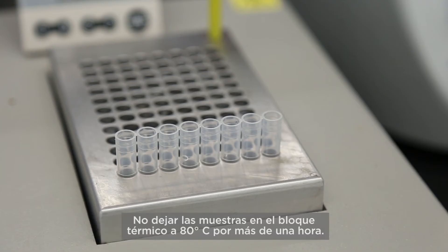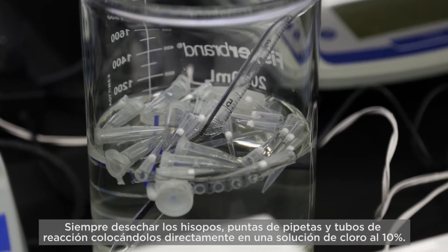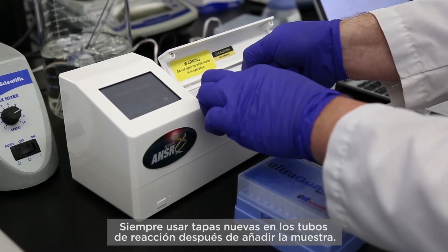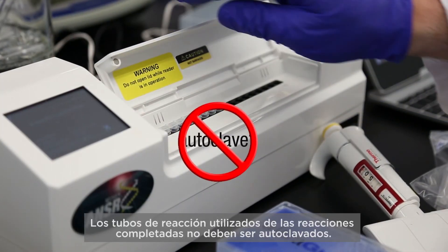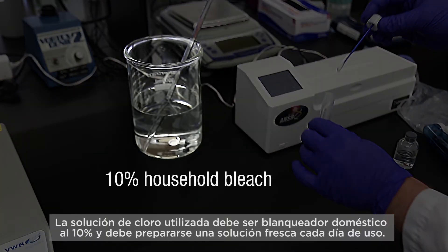Do not leave the samples in the 80 degree heating block for longer than one hour. Always dispose of the swabs, pipette tips, and reagent tubes by placing them directly into a 10% bleach solution. Always use new caps on the reagent tubes after adding the sample. Spent reagent tubes from completed reactions should not be autoclaved. The bleach solution used must be 10% household bleach and must be prepared fresh each day for use.